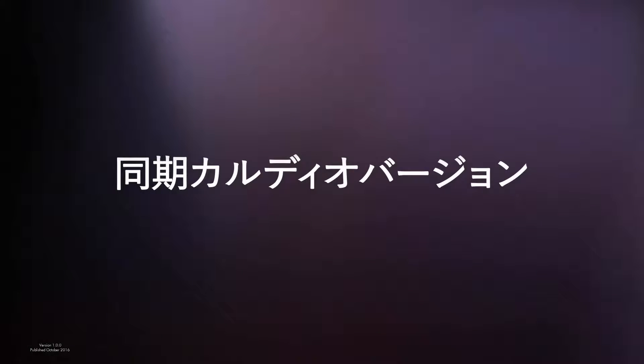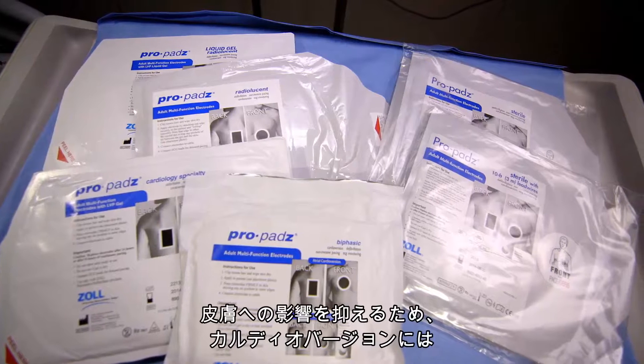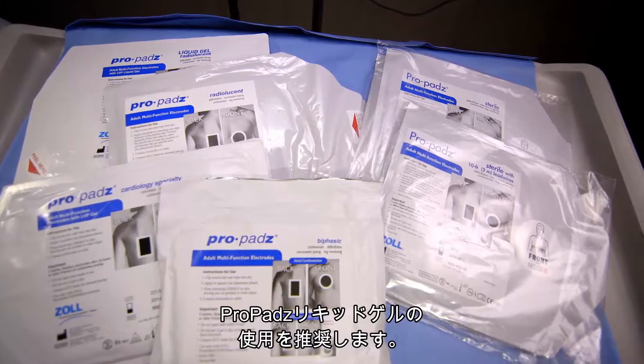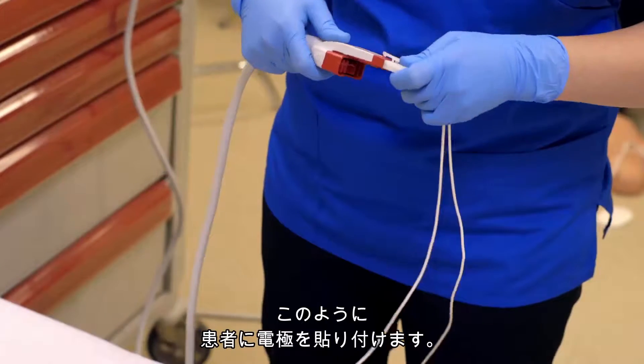Synchronized Cardioversion. For elective cardioversion procedures, Zoll recommends you use liquid gel ProPads for maximum efficacy and minimal skin effect. Place electrodes on patient as previously shown.